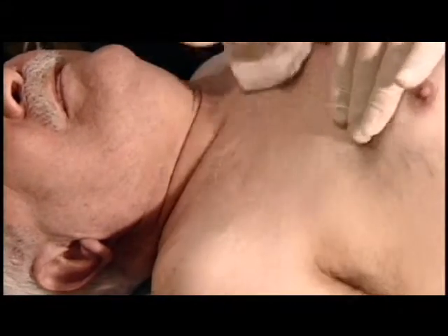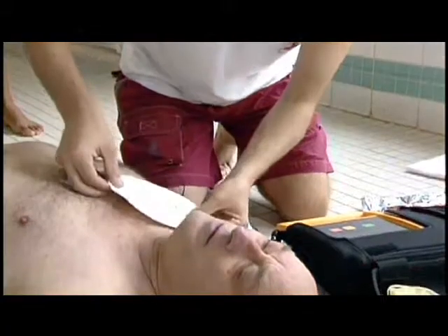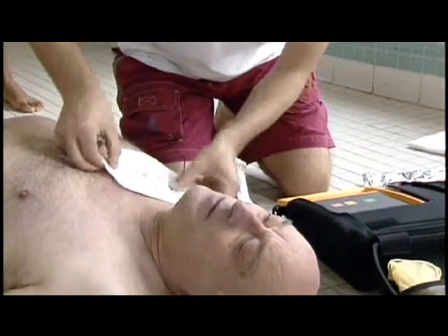Modern pacemakers can withstand the shock from an AED without problems. But if you notice an implant like a pacemaker or defibrillator, apply the pads around the implant whenever possible.